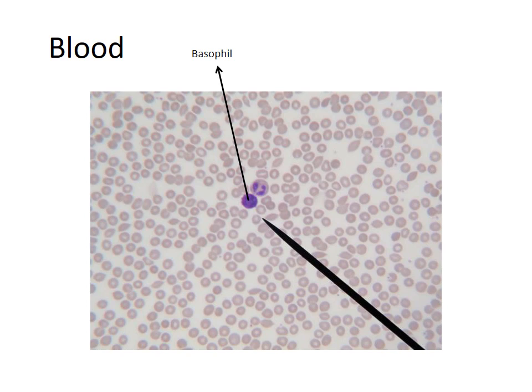Now, one of the things, hopefully you remember this or were told this in 210, which again, the way things were last semester, if you took 210 last semester, there was a lot of things that probably didn't get communicated as well. So just to let you know, anytime you hear basal or baso, it means bottom or lowest. This is called a basophil because it is the least common of all the white blood cells.